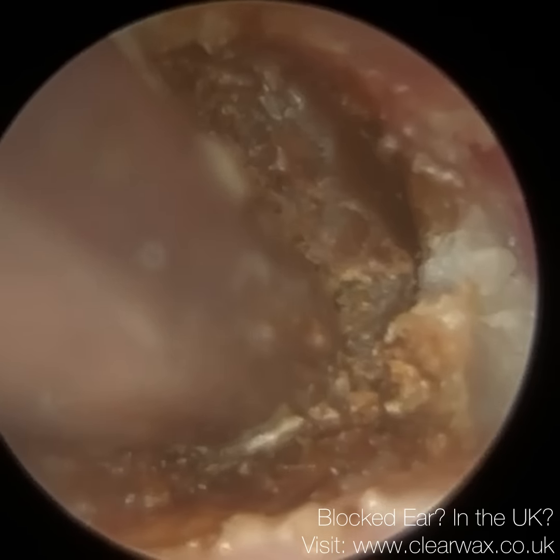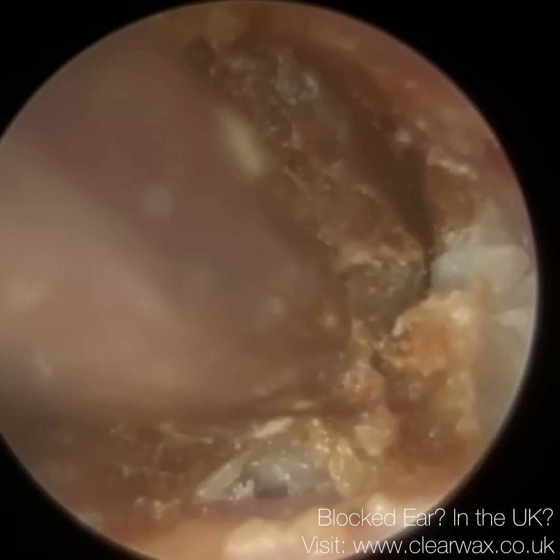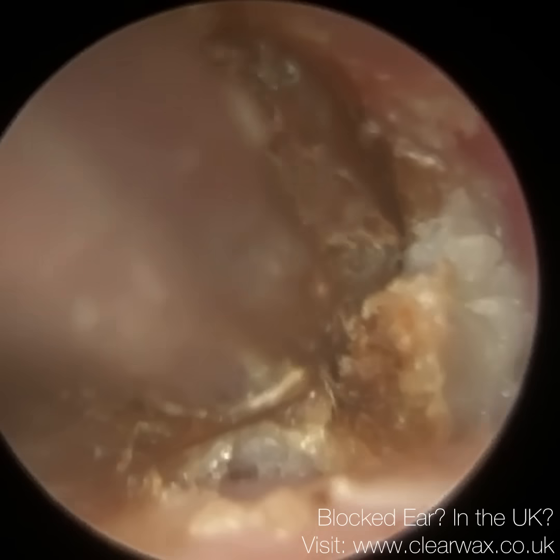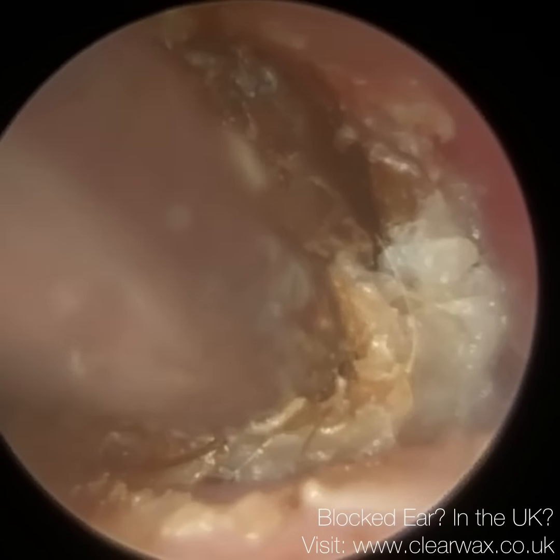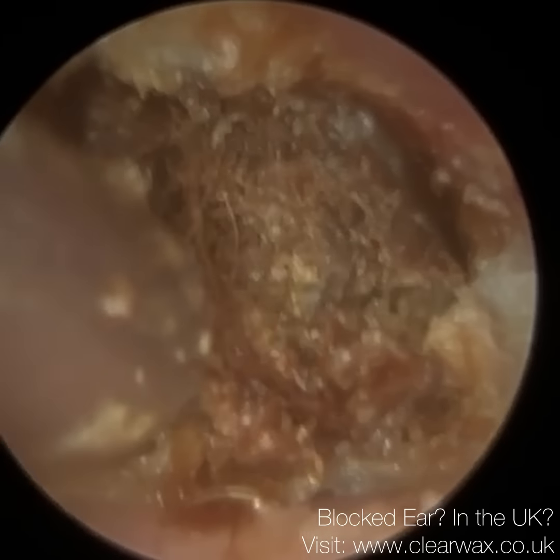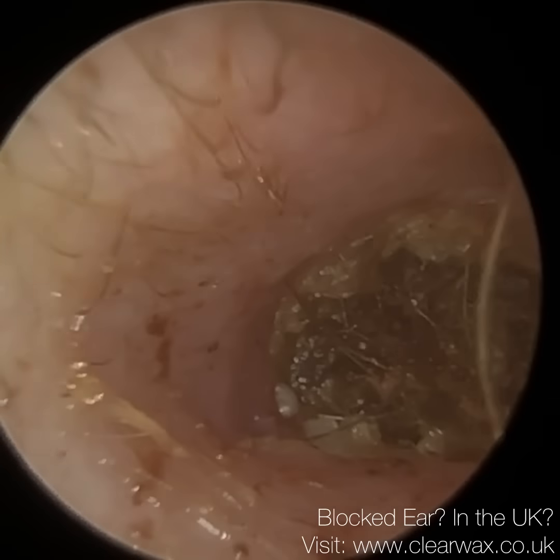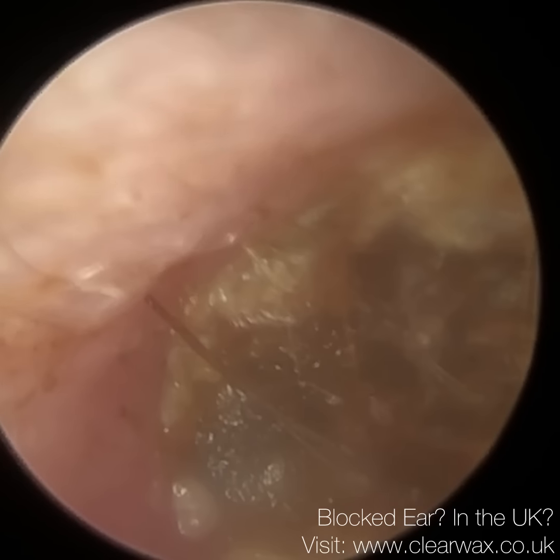And at the moment, I'm just evaluating the difference between using sodium bicarbonate drops and hydrogen peroxide drops, because normally I would recommend sodium bicarbonate drops for keratosis obturans. But I've used hydrogen peroxide on a couple of occasions now, and it's worked pretty well. So it's kind of broken down this skin plug, and it's going to help me now suction it out.